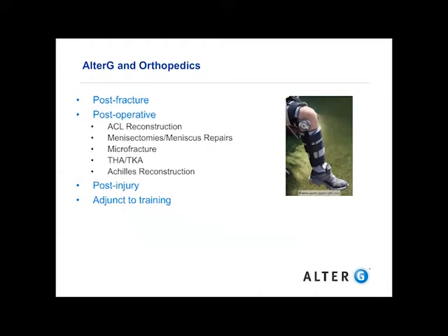their cardiovascular conditioning. One of the cool things that we see with people using the AlterG is that for total hip patients, if they want some type of cardiovascular activity or some type of range of motion, it's hard to get them on a bike because you may need to follow your post-operative precautions. Well, with the anti-gravity treadmill, you don't need a lot of hip flexion to get into it. So you can preserve and respect those precautions while allowing someone to return and start walking safely.